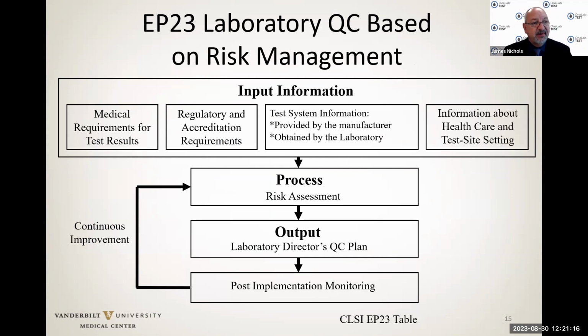But outside of the United States, there may be local, regional types of regulations that require laboratories to perform quality control, do certain things at a certain frequency. Then we have what's in the package insert, the manufacturer's instructions for use. That's the ones that are provided by the manufacturer about the test, its accuracy, its precision, and what we obtain as a laboratory by maybe picking up the phone, writing an email to our colleagues who are using this test and asking them, hey, what have you been doing? What have you seen as potentials for error?